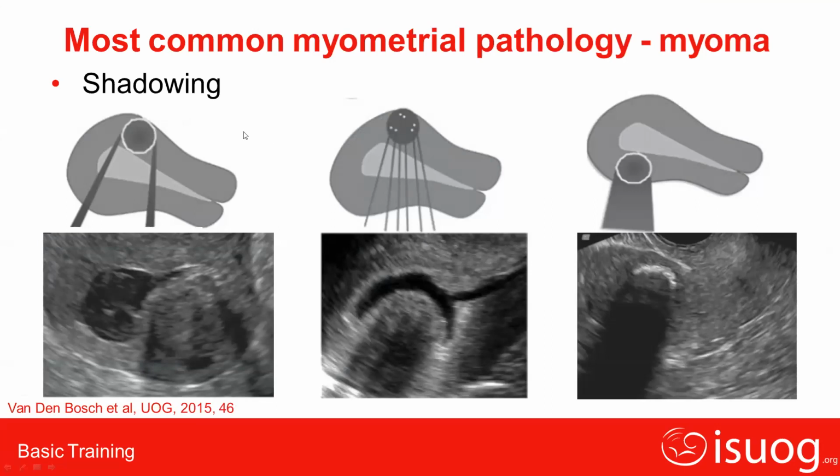Now next is shadowing. All the myomas are hard structures. As we see, when we take out the myoma, it is so hard. We should remember that this is the outer line of the myoma, and the outer line of the myoma is a pseudo capsule. It's not a true capsule. What do we mean by pseudo capsule? When the myoma increases in size centripetally, it compresses the smooth myometrial fibers around it, and that forms the pseudo capsule around it. See, this is a pseudo capsule around it.